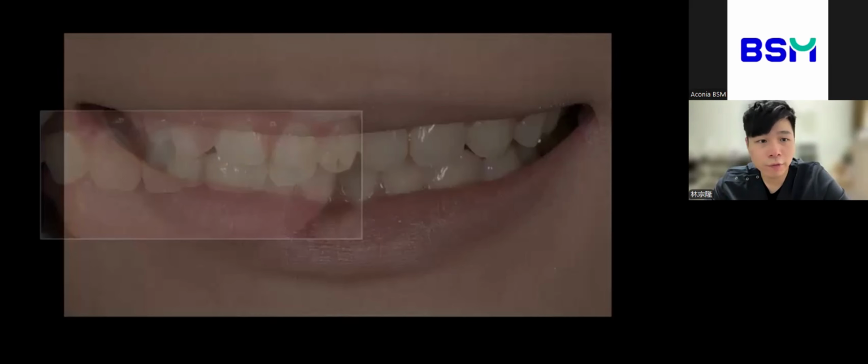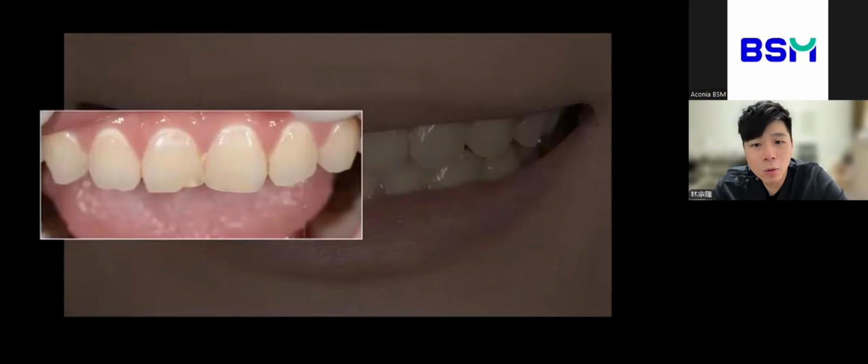From the intraoral photos, you can see there are many old composite restorations. Because of that, dentists usually become more conservative during the preparation because they don't want to remove too much tooth. And it's hard to know how big the composite actually is. At this point, deciding to place the margin on composite or natural tooth becomes very tricky. So the most difficult situation is when the entire composite has to be removed. That makes margin refinement much harder.